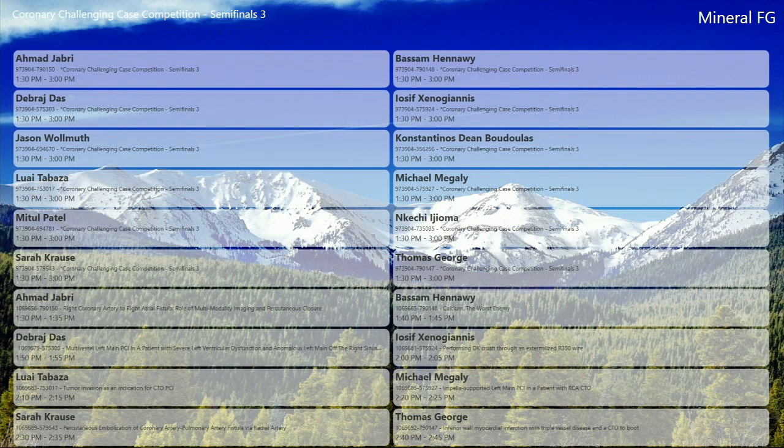I don't know, Jason, what do you think? Yeah, I think in this case, they got a nice shot down the vein graft, and you could see that there didn't appear to be any trauma to the PDA that was going to need to be addressed. So I think at that point it's probably fairly safe just to jump in and get the coil. The other thing is if, God forbid, he did have a dissection, you've got access and you've got a wire across it, so I think it'd be pretty safe at that point.